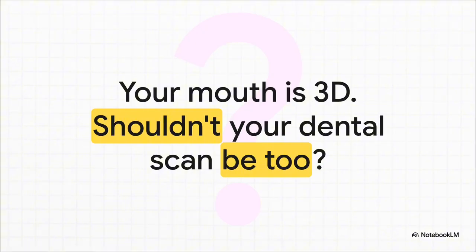As this tech keeps getting better, we're getting closer to a type of dental care that just makes more sense. It matches how we're actually built. I mean, everything about your mouth is 3D. So, shouldn't your dental scan be too?